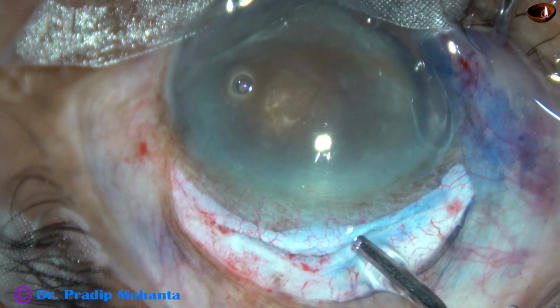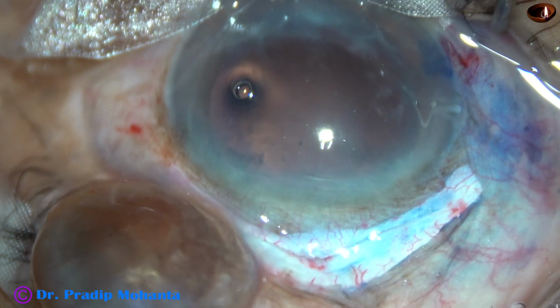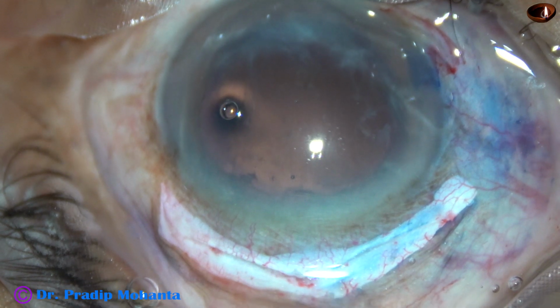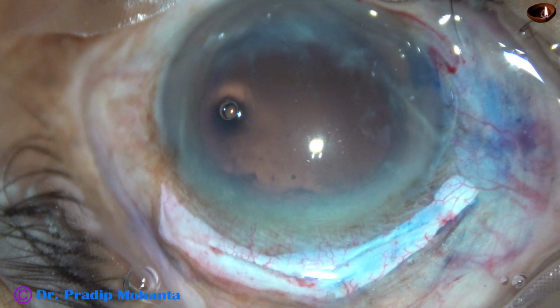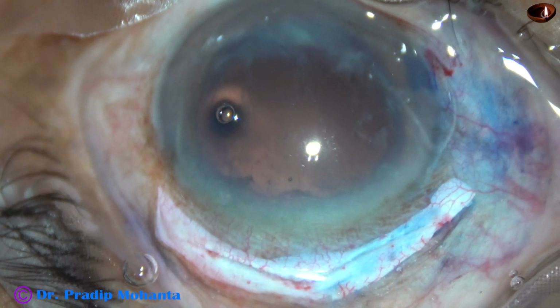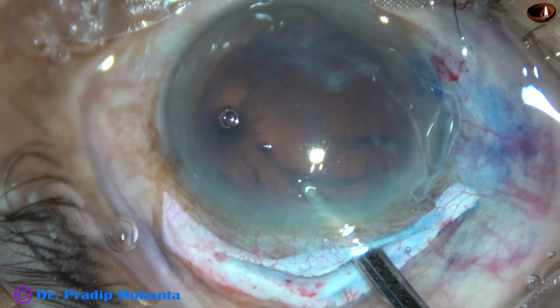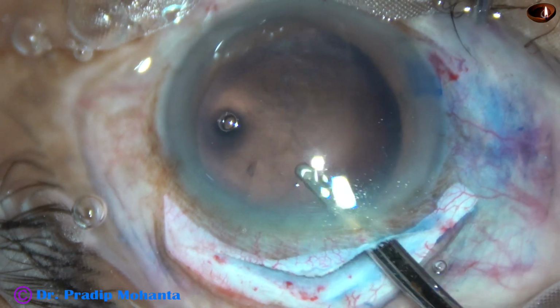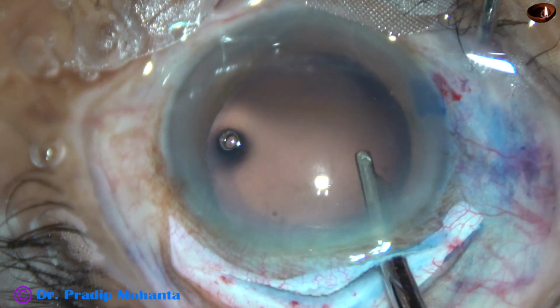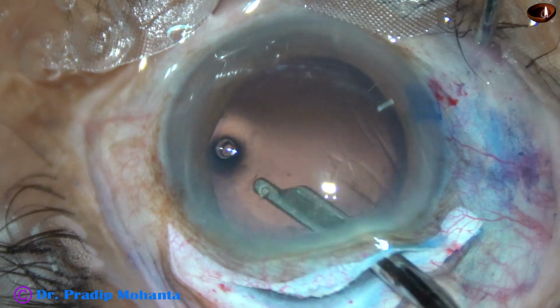As we inject visco behind the lens, it will come out, and it comes out very nicely. And now cortical cleanup is to be done. There is very little cortex. Most of the cortex had turned into a milky fluid, so we just have to aspirate the milky fluid. And now the fibers are removed.